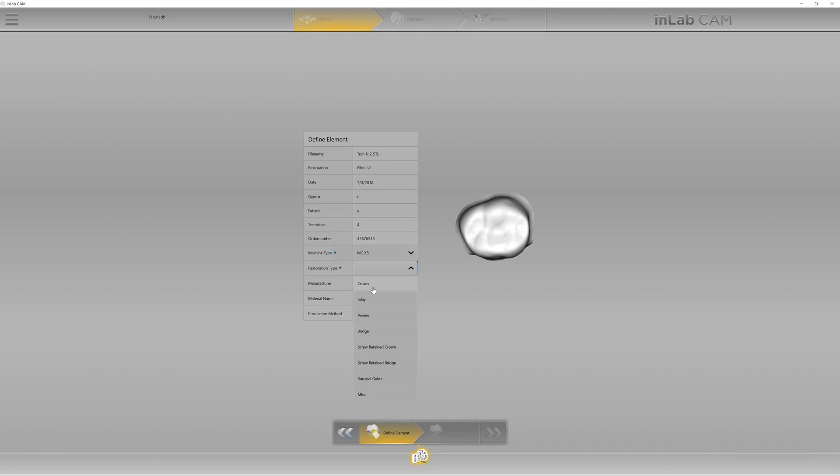Restoration type, we have a crown. I'm going to use miscellaneous zirconia.